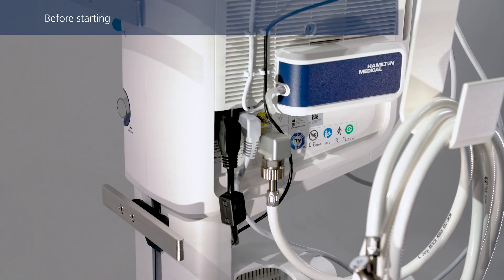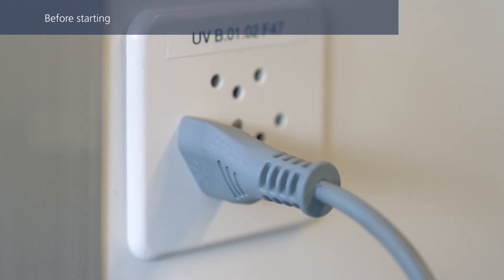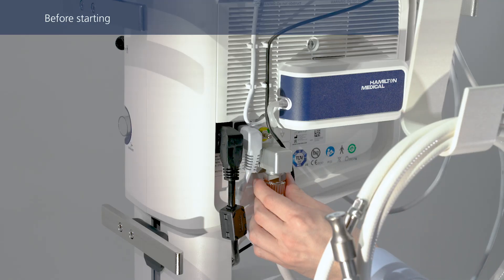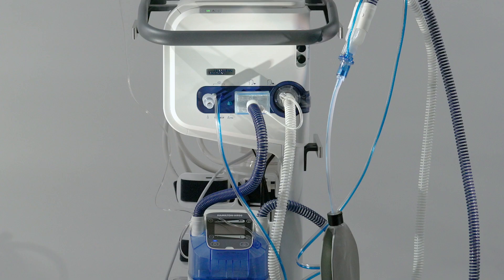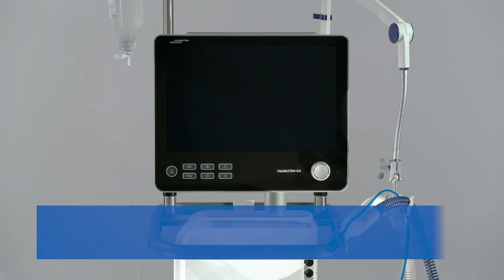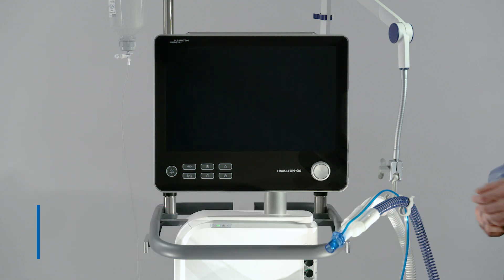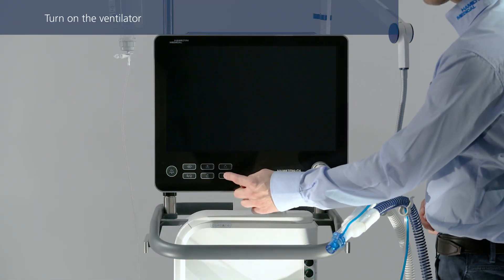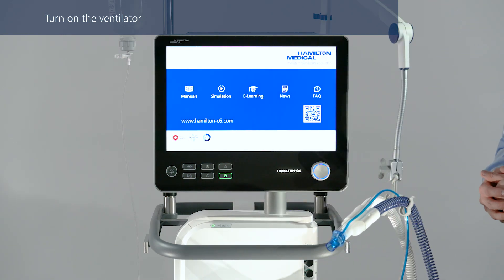Before starting with the pre-operational checks, ensure that the ventilator is connected to both primary power and an oxygen supply. Ensure you are using the correct flow sensor for the patient. Verify that the breathing circuit is assembled correctly. Then turn on the ventilator.